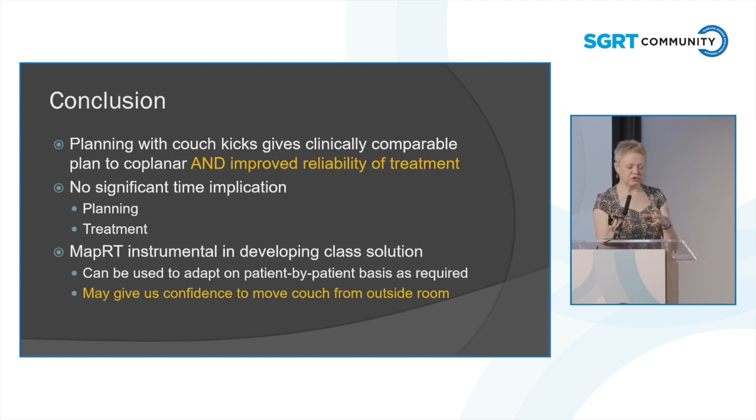Yes, I could have gone into the department. I could have found time on a Linac to actually check this, but that would have only showed me the couch. It wouldn't have shown me any problems with the patient. And also, let's face it, I'd much rather work from home with a cat on my knee in my pyjamas than have to trot into work and get on a Linac.